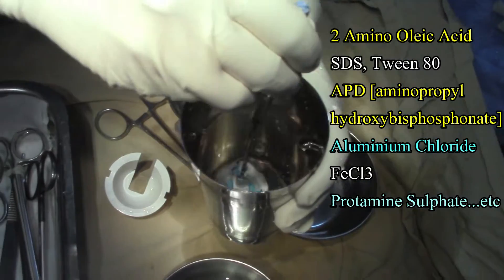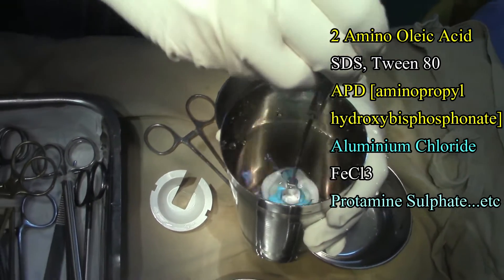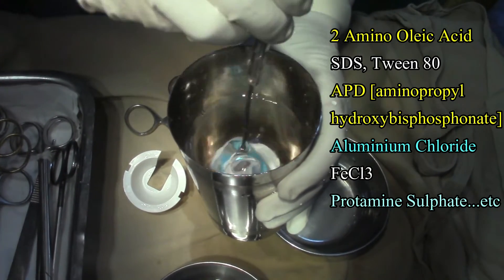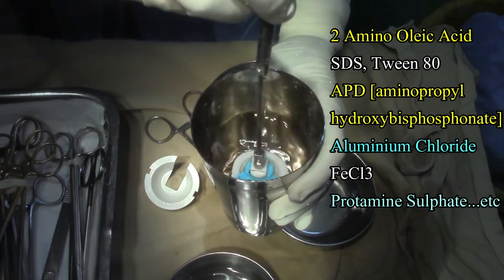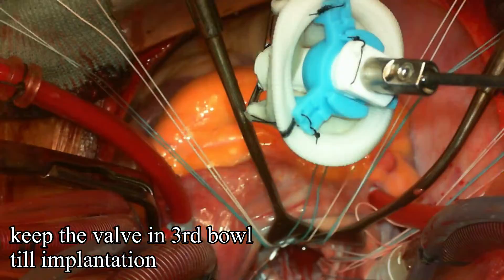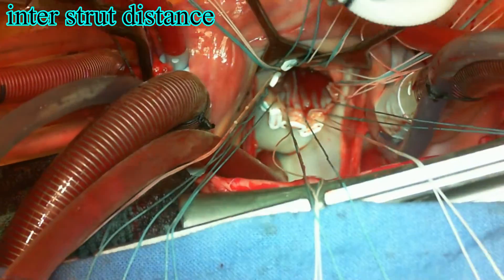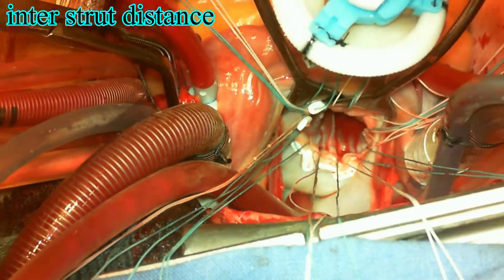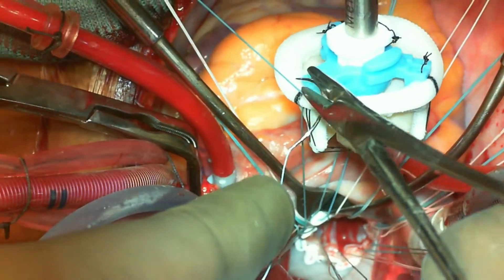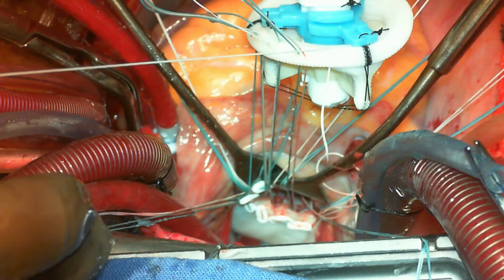Once the third bowl rinsing is done, one has to keep the valve within that bowl until the surgeon asks for it for implantation. Based on the number of sutures placed — which can be counted from the organizer used — there are markings on the valve, as you can see here: black markings that indicate the inter-strut distance. One has to equally distribute the sutures through the valve sewing ring, dividing the number of sutures into three slots corresponding to the three struts.